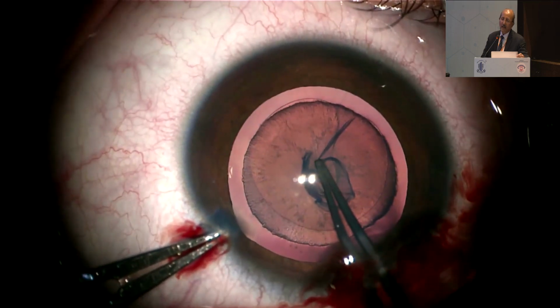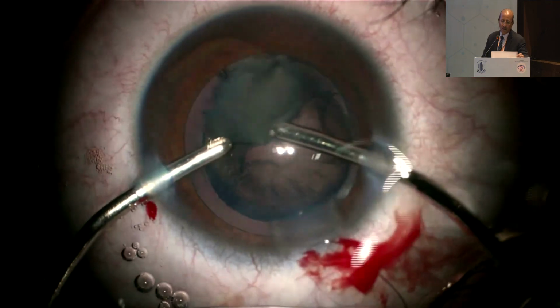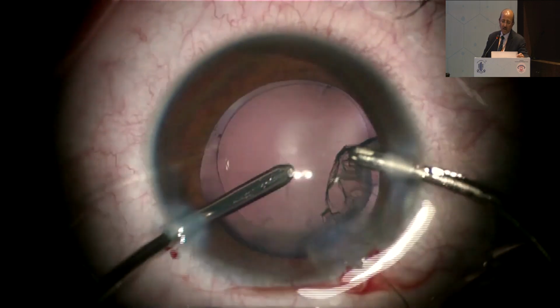If you try to make it large, it will be very large. So make it precise, about 5 to 5.5 millimeter. Hydrodissection is followed by removal of the cortex from the capsular bag.